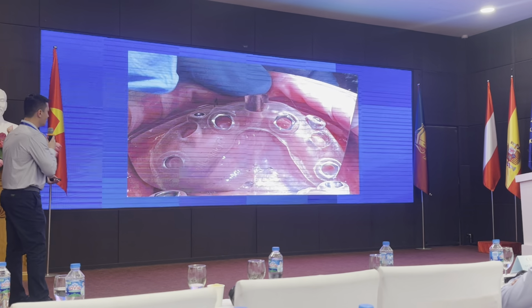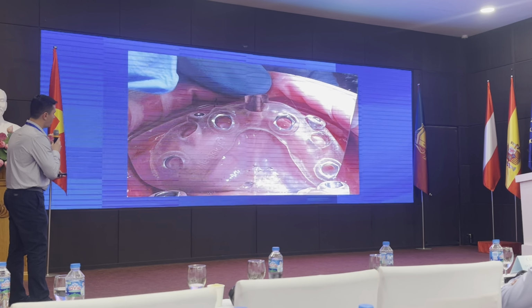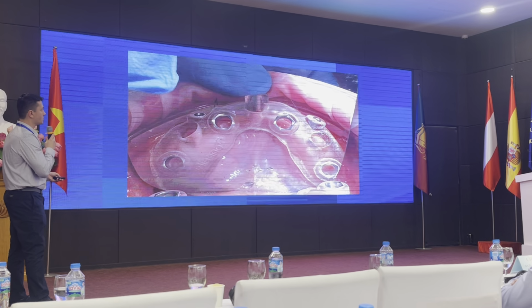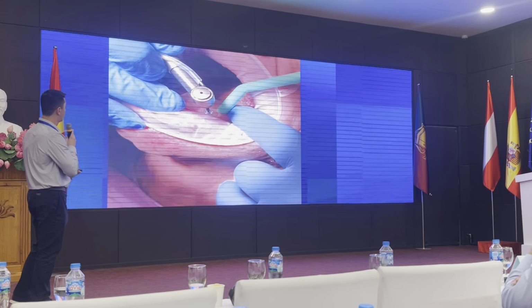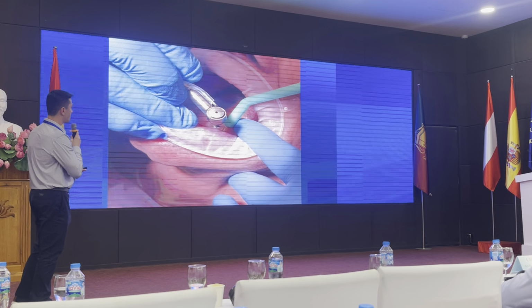There's the guide seated. So we have holes here, and right here in the middle too. These little cut-through windows help us to make sure that the guide is fully seated against the soft tissue. So we're drilling the fixation pinholes here.